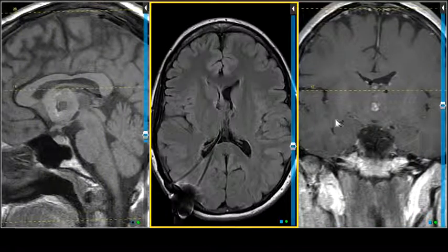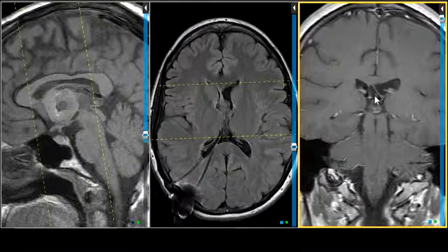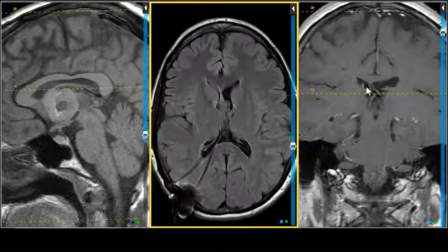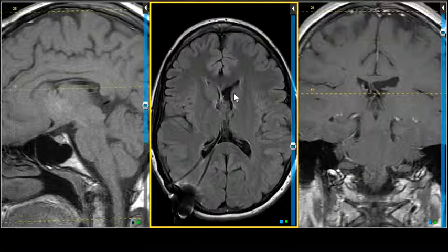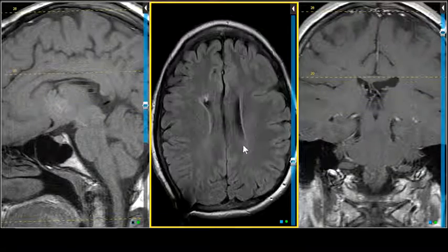Now, this is heading for the frontal horn, so that's in a little better position, so that's probably got holes exposed, so that may be working. Could you point to that shunt in the axial? Right there, okay. Cross-reference it. And so here it's the tube coming right up here. Gotcha. Okay, and so, but there's an asymmetry here. So it may very well be that this is getting drained more than this, so I'd have to keep an eye on this one, make sure this ventricle is not getting trapped. Okay? So that's one thing to talk about, is how is our shunt working?